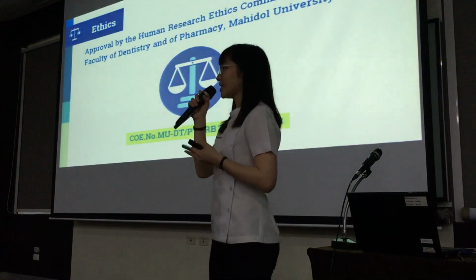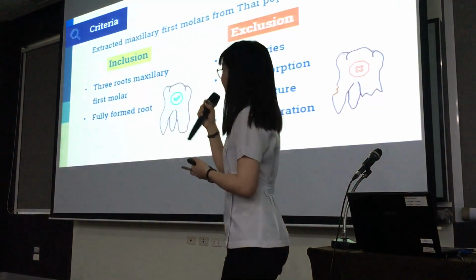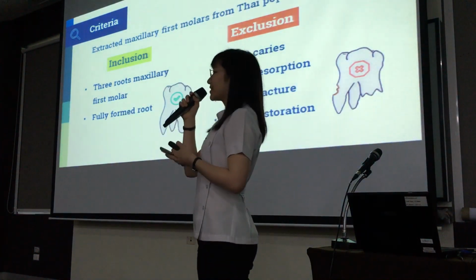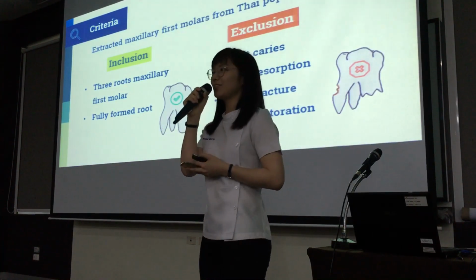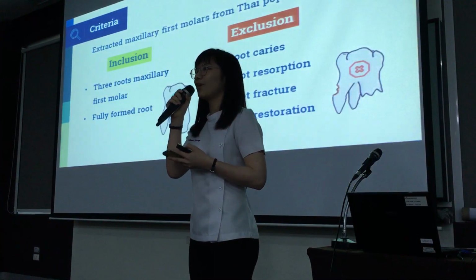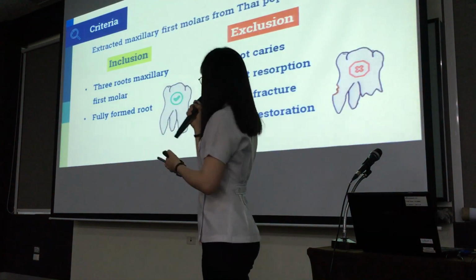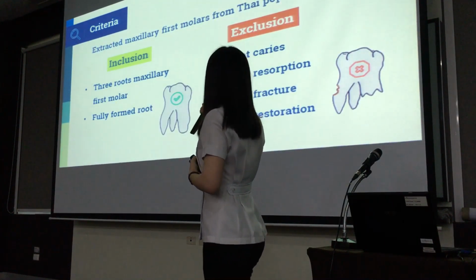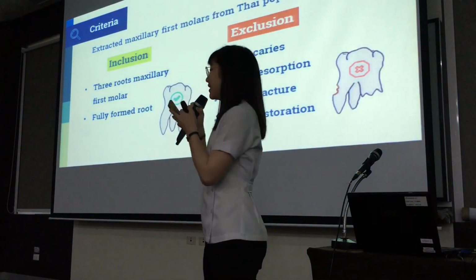This research was approved by the Ethics Committee. For the sample preparation, extracted maxillary first molars from Thai people, from which personal information cannot be identified, were collected following the inclusion criteria. Teeth with root caries, root resorption, root fracture, or root restoration were excluded from this study.